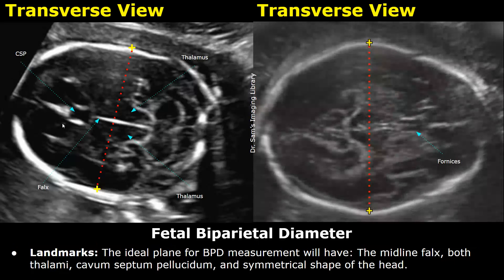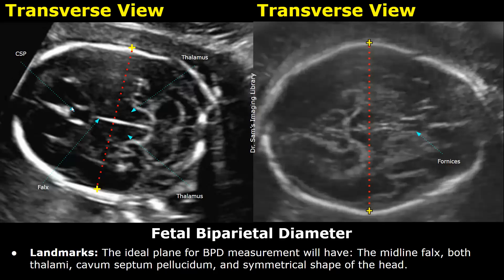For measuring the BPD, an ideal landmark is to take the measurement when you see the midline falx — this hyperechoic midline falx — with both thalami on either side of the falx, and the cavum septum pellucidum, this rectangular anechoic structure, and a symmetrical shape of the head.